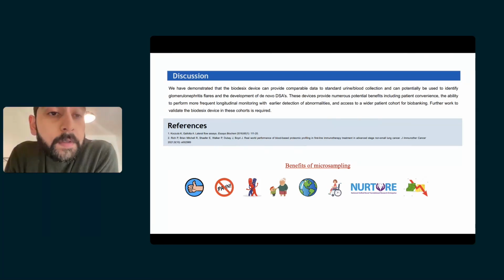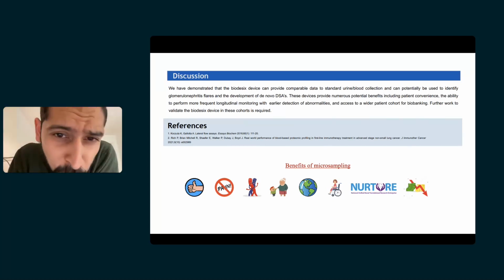So our results definitely demonstrated promise of, quote unquote, a microsampling device, rather a blood collection device, in monitoring biomarkers in patients with CKD, specifically those with a kidney transplant and those with glomerulonephritis. But obviously, our patient numbers are small, and further work needs to be done to validate this device in larger and more representative populations in different conditions, including different temperature settings and at different time courses.